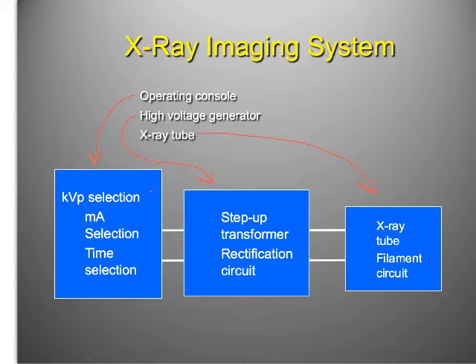It's stepped up the number of turns. If you look even on that illustration, it's got a number of windings around that core. The windings on the first side, the left-hand side, are less than the windings on the right side, that secondary side. And so a step-up transformer has more windings on the secondary side. That is what a step-up transformer is by definition.